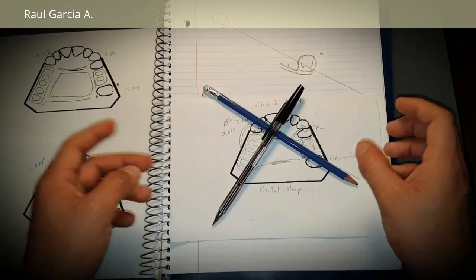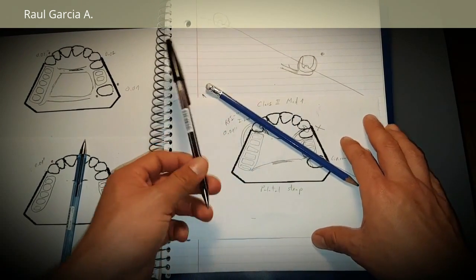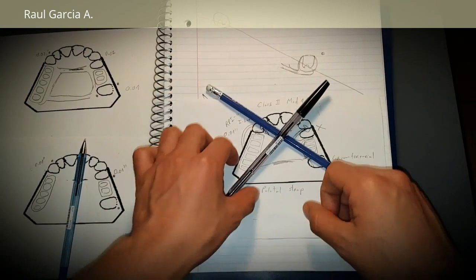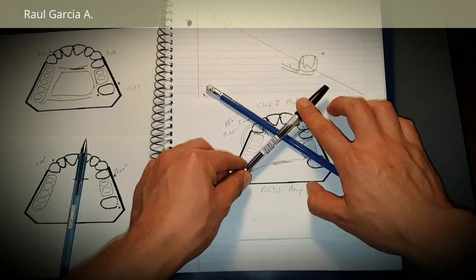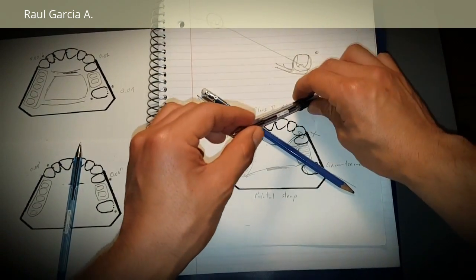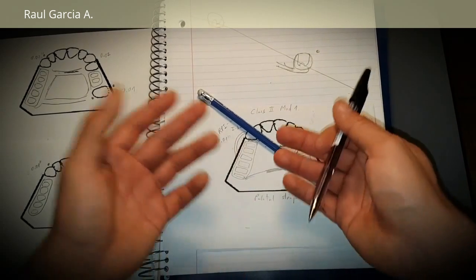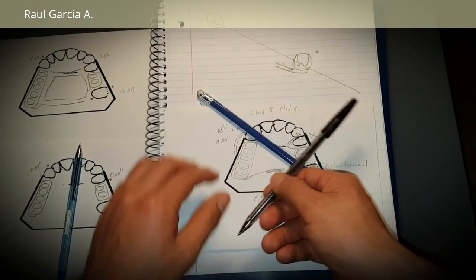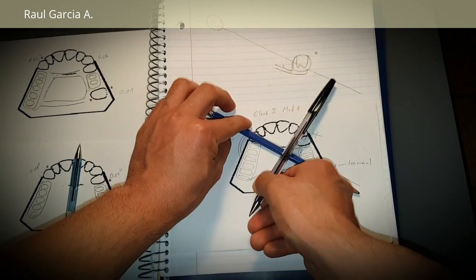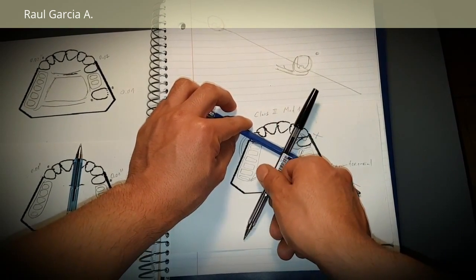Okay, so the other component you have to think of is that whenever you have a saddle area, you always need to put indirect retention, because if you don't have anything here to support this movement, the RPD is just going to go like this, too much. It's going to press the gingiva and damage structures. So remember, the line has to be 90 degrees, and you start analyzing which tooth fits better as an abutment for an indirect retainer or indirect retention.